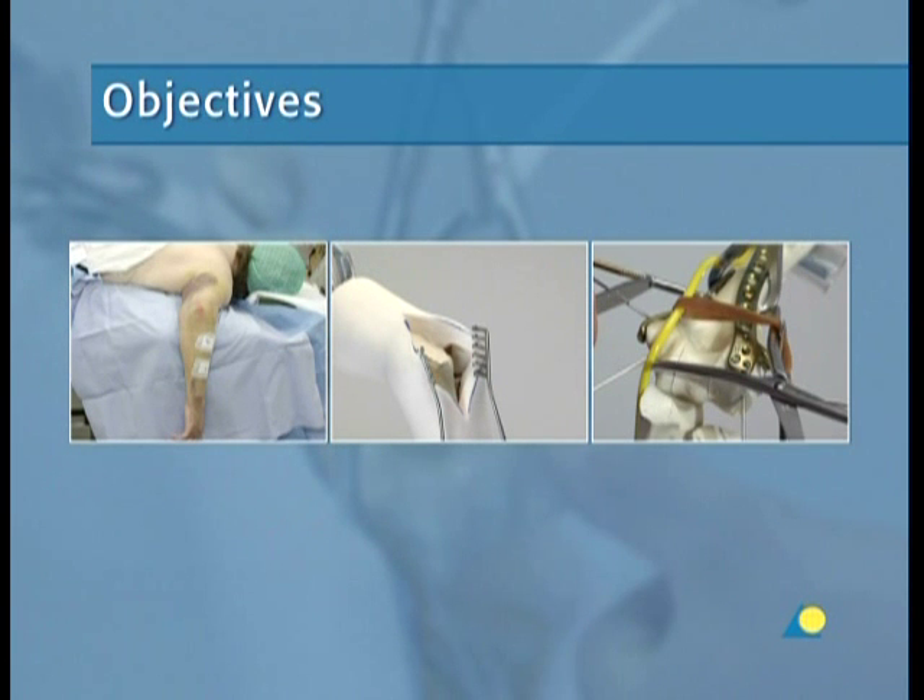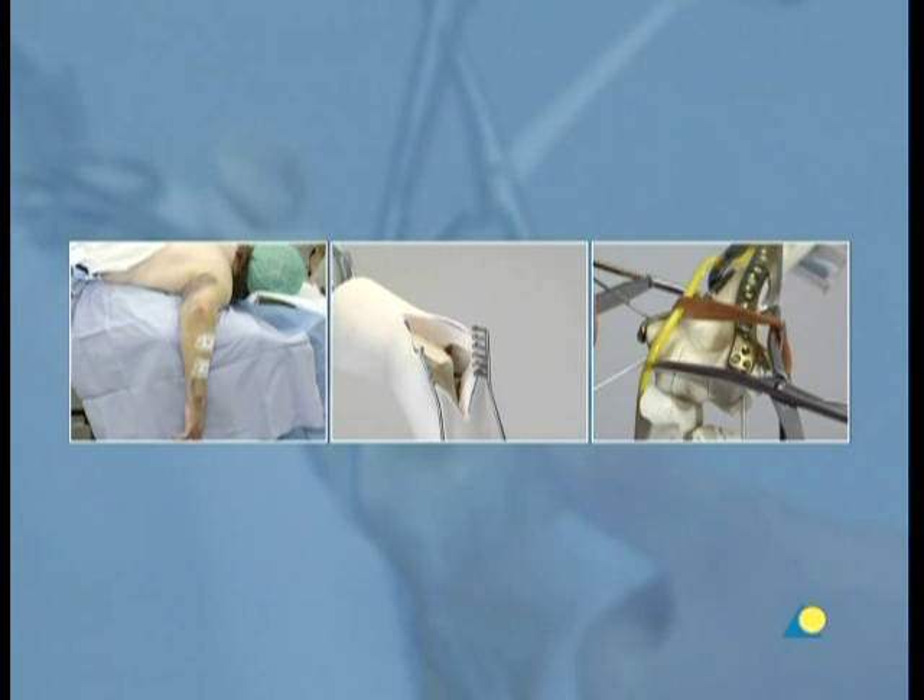The objectives of this presentation are to demonstrate the surgical approach, the exposure of the fracture zone, and the application of the distal humerus plate system to a very distal C1 humerus fracture. The exercise is designed to make clear both the function and practical application of the distal humerus plate system.